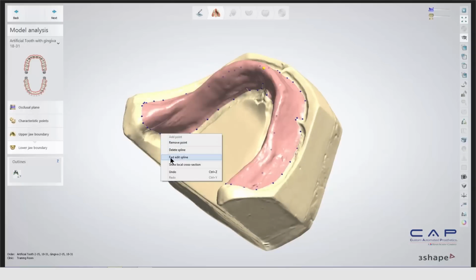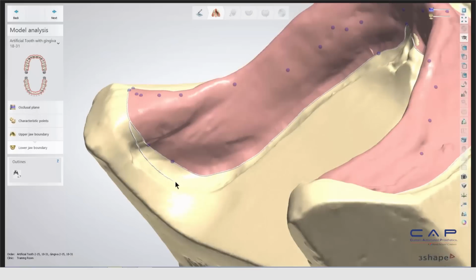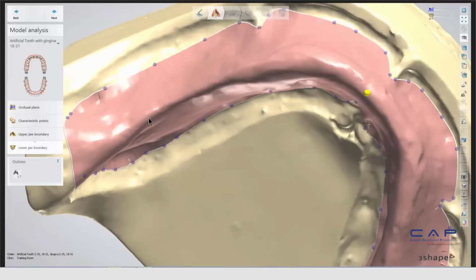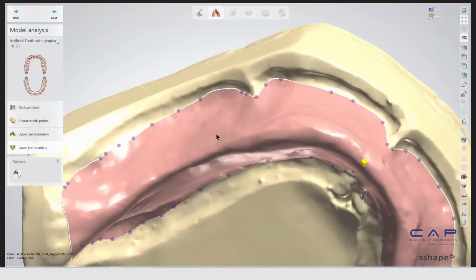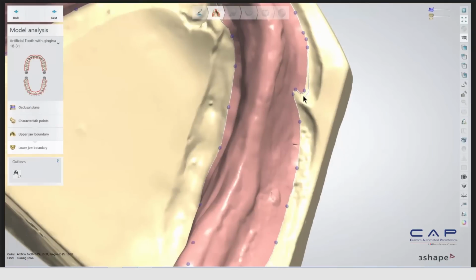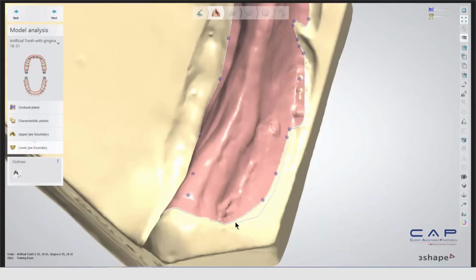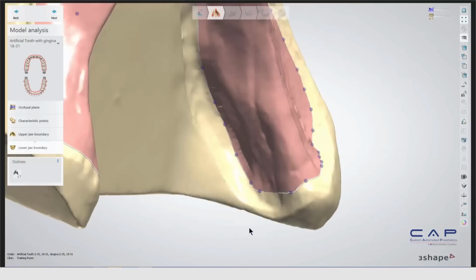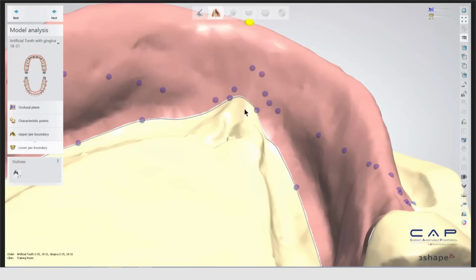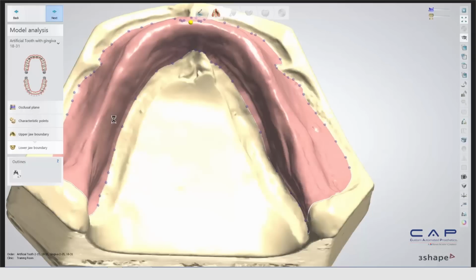Okay, so right click on the line, do Fast Edit spline, and then go ahead and mark where you want those areas to be. So go ahead and drag that down a little bit more. And just customize it how you see fit. Too far out that way. Okay, looks good enough. We'll fix this area here. There we go. All right, now we're going to move on to the next stage.